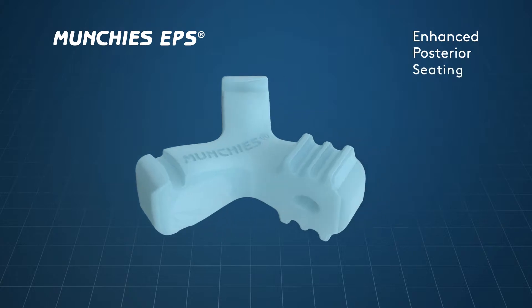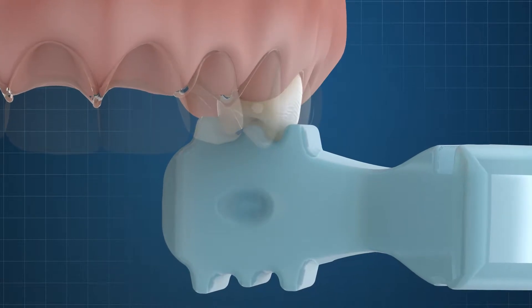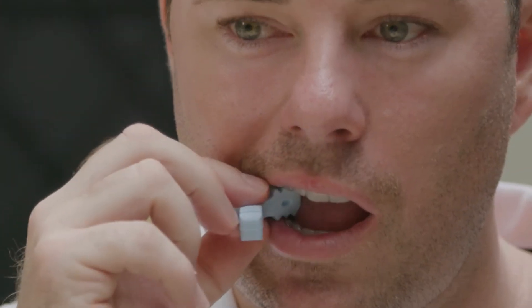Munchies EPS have been designed to optimize the seating of aligners in the premolar region in particular, where most expansion is programmed. The principle is the same as for the anterior teeth, whereby optimization of seating and fit will ensure that pre-programmed forces are delivered accurately.